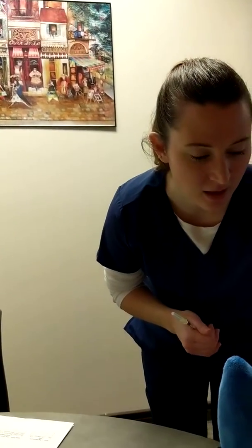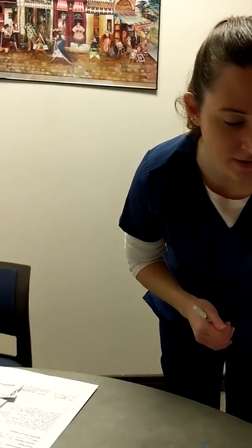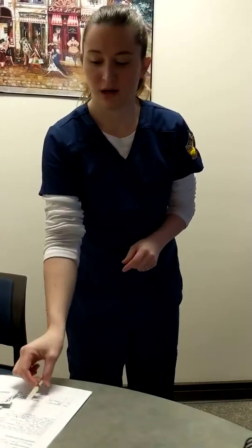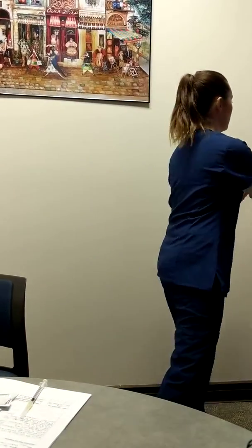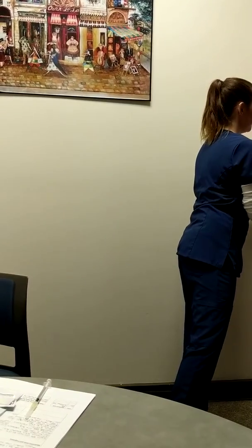Before we begin with that injection, can I check your name and have you verify your name and date of birth for me? Skip Rocker, and I was born January 1st of 1979. Perfect. I see you have an allergy to Celebrex, and we're not giving you that, so we should be good to go. Alright, I'm going to wash my hands. Get some gloves.